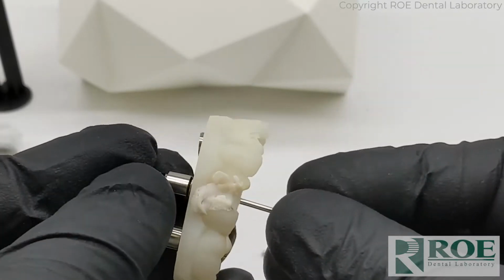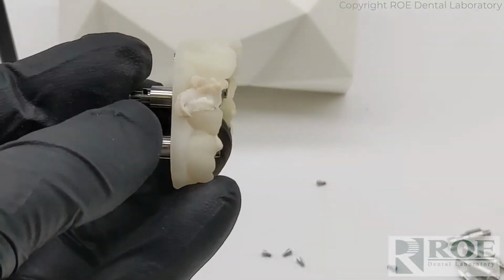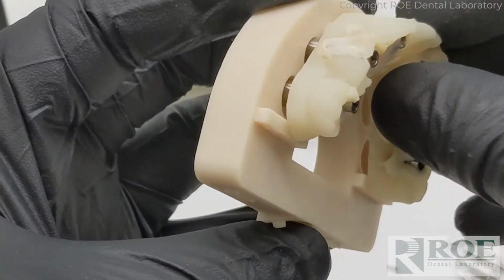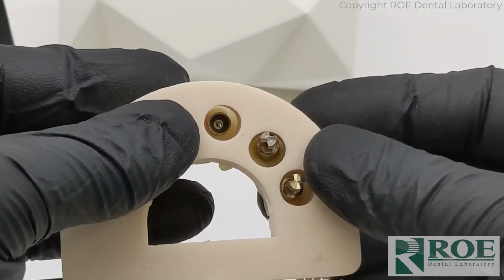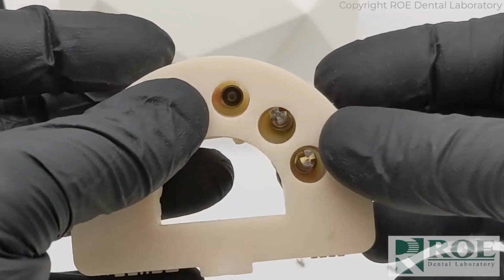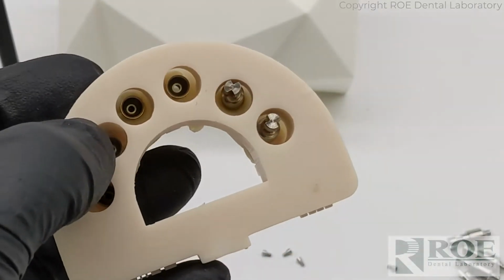Because these are straight, really should be a very simple process to add them all, and then just plug it into the model. So I'm just going to demonstrate these first two, and you can see here that they're fitting. This one's not quite in the middle, but it's not quite touching either, so that's acceptable. So let me add the other four, and then we'll move on.